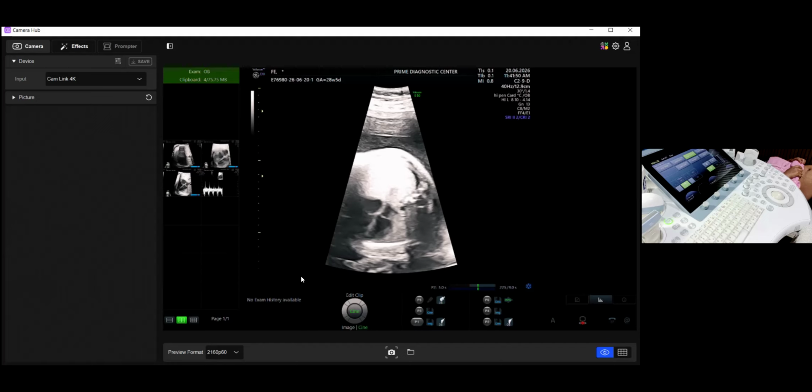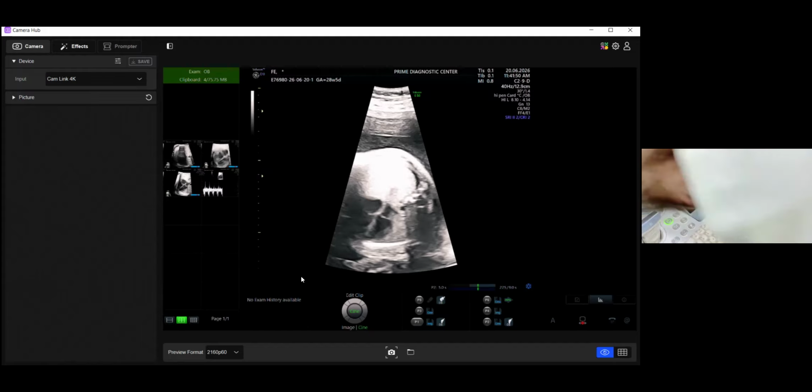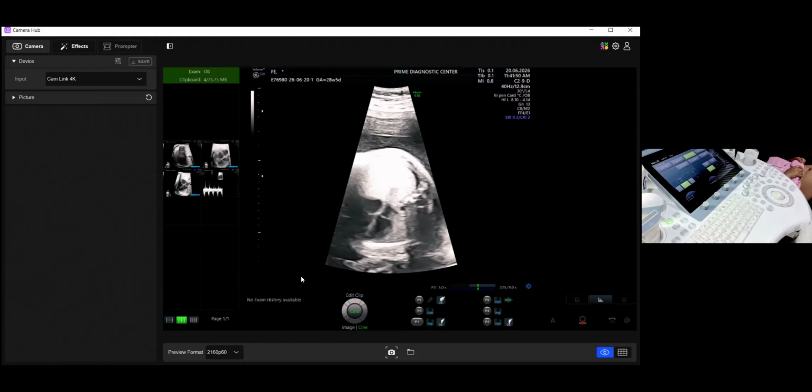One of you has to be here always, okay. So we are now back to work and scanning another patient.